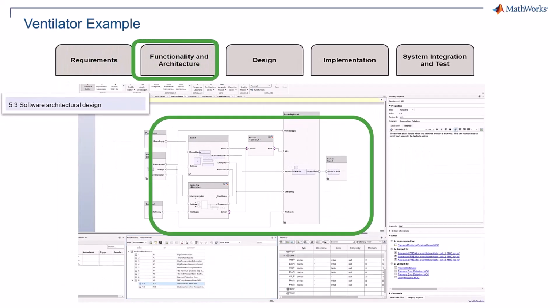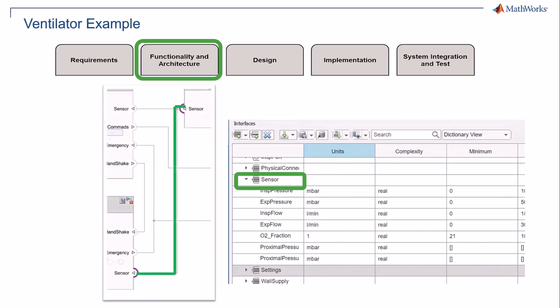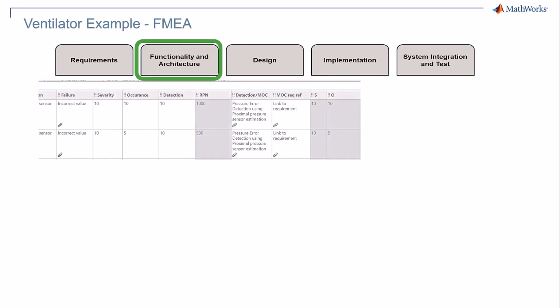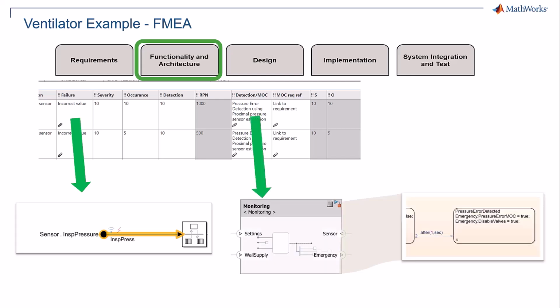Chapter 5.3 talks about software architecture, which maps to the system engineering workflow using System Composer, which allows you to do all system engineering tasks such as adding attributes to your components and doing roll-up calculations and optimizations on a system level. Here you can see the interface specification for the sensor port. The interface specification is an important part of the architecture, but you can also use this interface as a starting point for your FMEA. In order to automate your FMEA, you first need to add behaviors to all your components, then create links between each failure and the implemented faults, and then add links between the detection method decided and the implementation of that detection method.